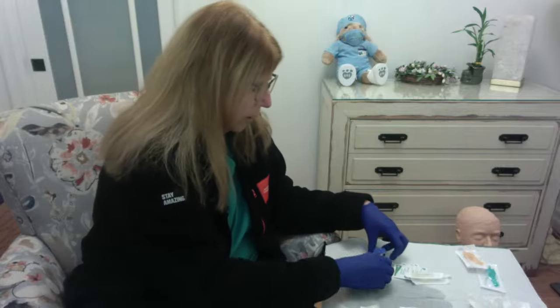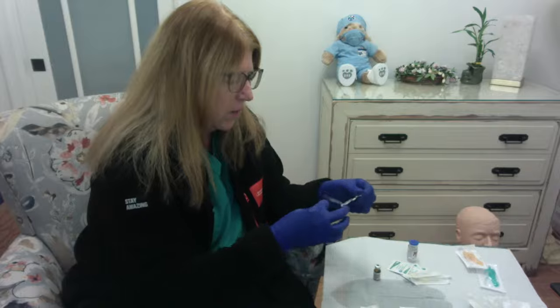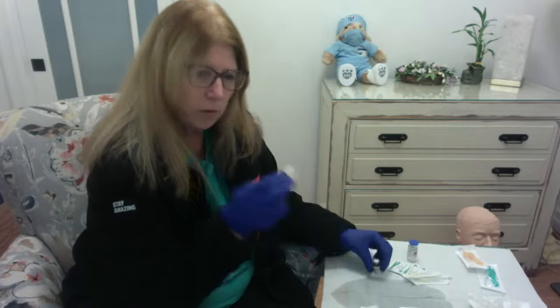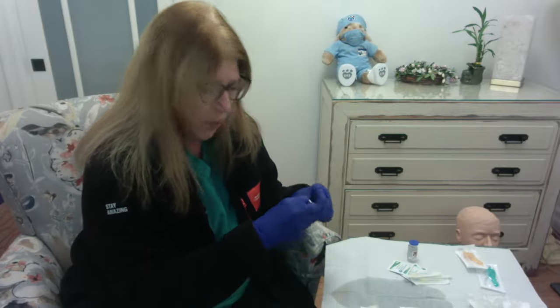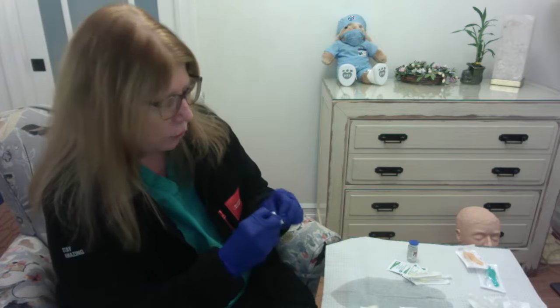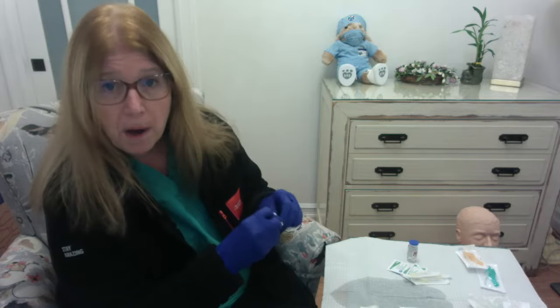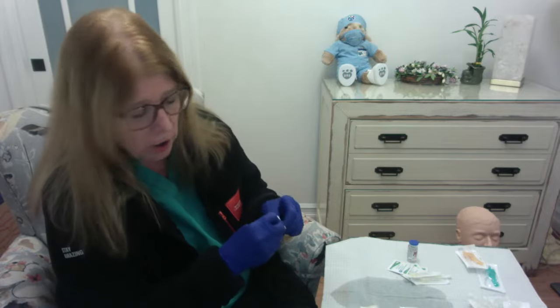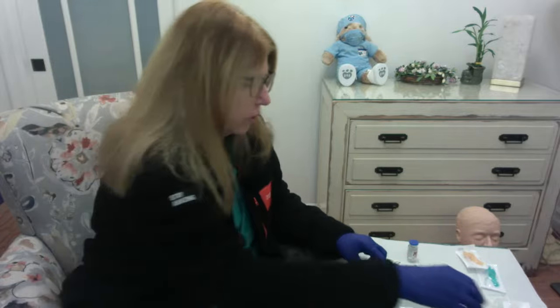Okay. So the first thing I want to do is I want to clean off the top of the vial. Even if I just took the cap off, I need to clean off the top of the vial. So I'm going to use the alcohol swab, and I'm going to do a 30-second scrub the hub. Okay, 30-second scrub the hub. I'm going to let that air dry, and then I'm going to choose my syringe and needle to meet my needs. Whatever kind of injection I'm giving, however many milliliters I need, I'm going to need the correct size.